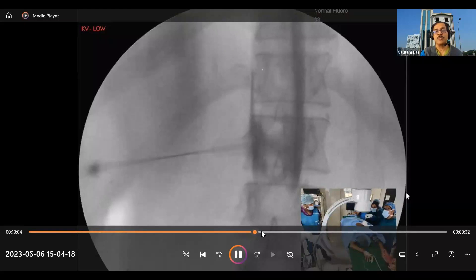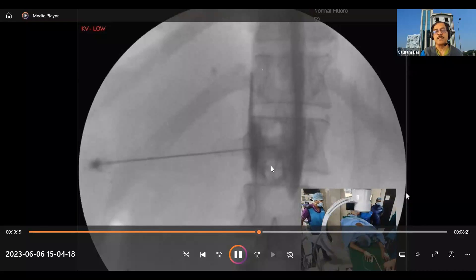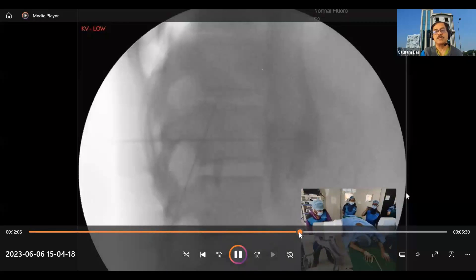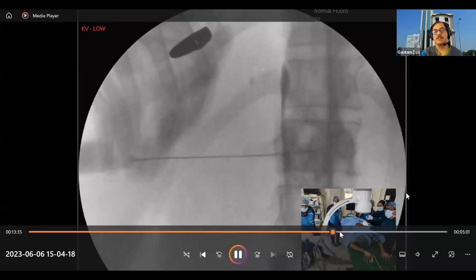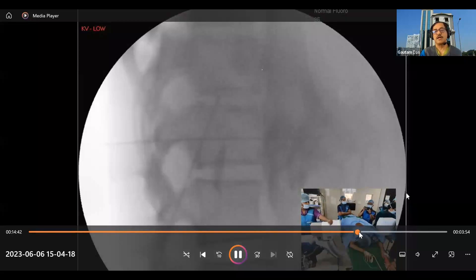This is your celiac trunk and this is your mesenteric artery. The needle is now positioned just in between the celiac trunk and the mesenteric artery, going through and through the aorta. At this position, we give local anesthetic, then alcohol, and take the needle out. Before giving the alcohol, we inject a little more dye to confirm we are in the right position, then give approximately 20 cc of alcohol and remove the needle.